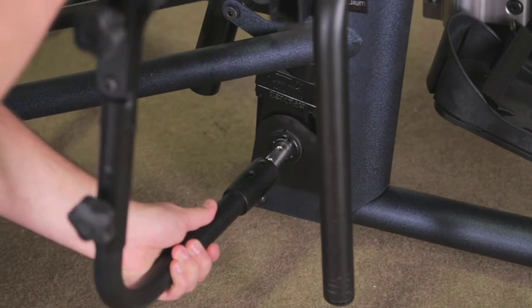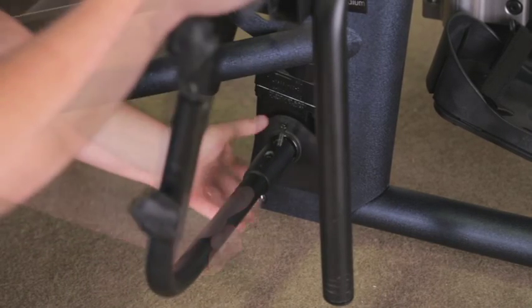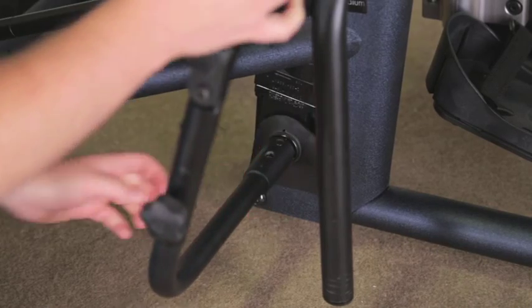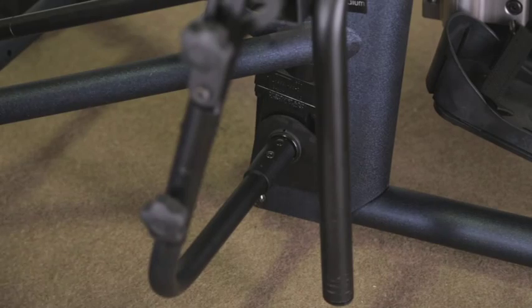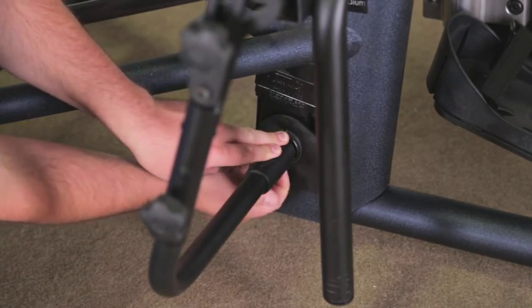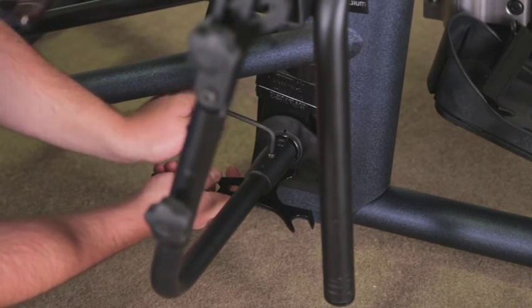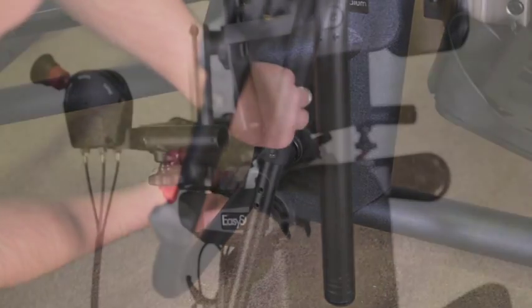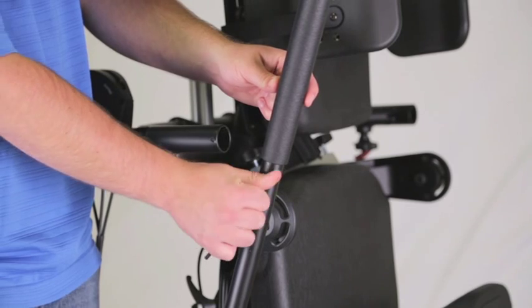Attach the pump handle to the pump on the seat assembly with the bolts and nuts. Use an allen wrench and the wrench from the tool kit and tighten securely. Insert the top of the handle into the pump handle and tighten bolts securely.